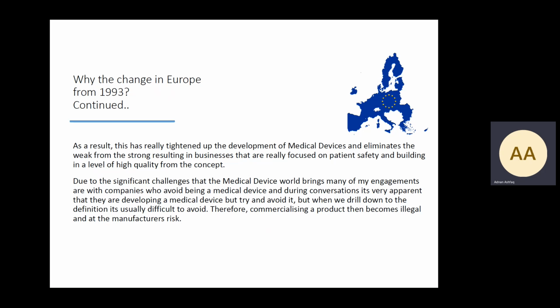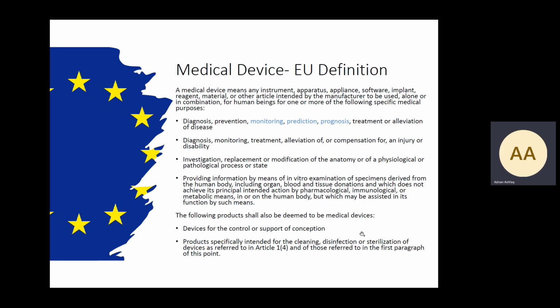Due to the significant challenges that the medical device world brings, many of the engagements I have at Simply Medica are companies who try to avoid being a medical device, but during those conversations, it becomes very apparent that they are developing a medical device, but try and avoid it just because of the complications, the cost, etc. But when we drill down to the clinical claims, it's very obvious that it's difficult to avoid the medical devices sector, and it then becomes a commercial or legal risk that the manufacturers have to consider.